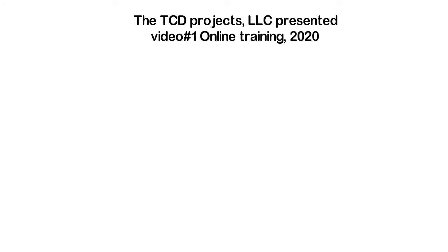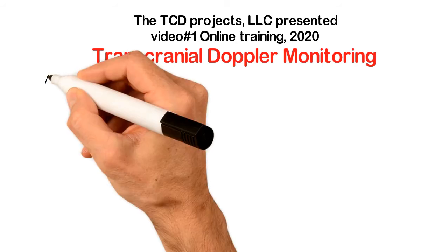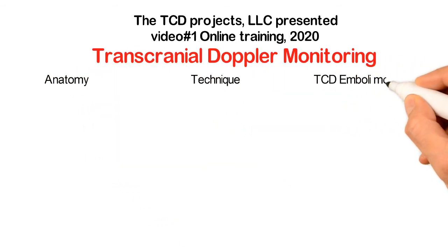TCD Projects LLC presents video number 1, online training 2020: transcranial Doppler monitoring, anatomy, technique, and TCD emboli monitoring.